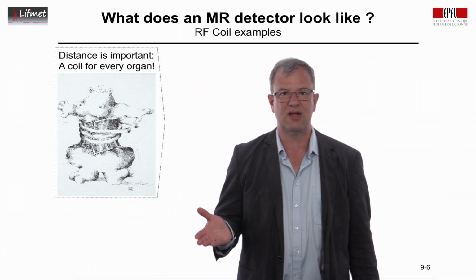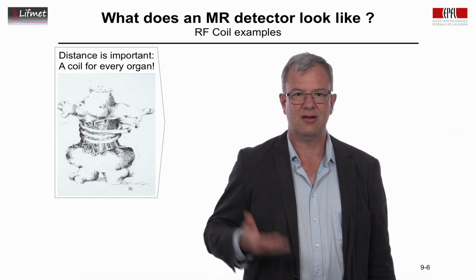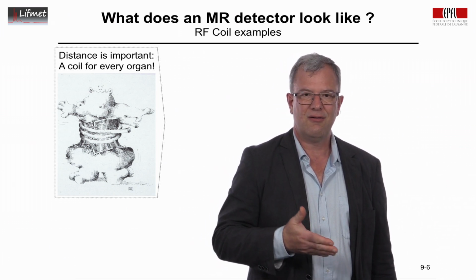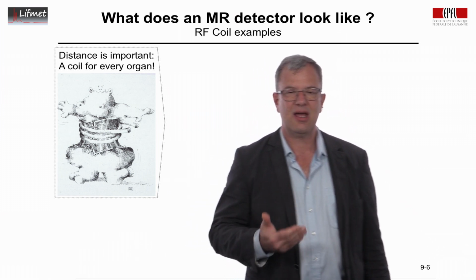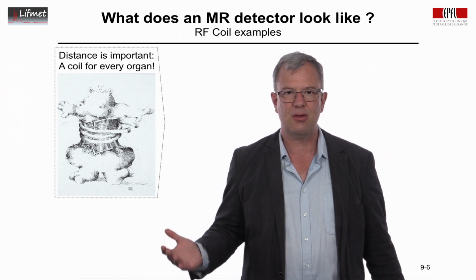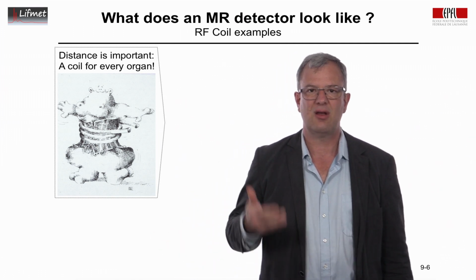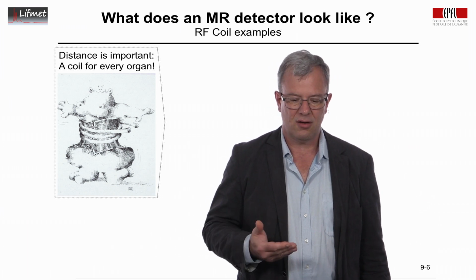Clearly the hippo here is not happy, it's not comfortable. This is not a situation that is ideal for comfort. What this also means is that our detector is not going to be a detector built for the human body to detect everything from the human body, but we are going to have a detector for every organ of interest.